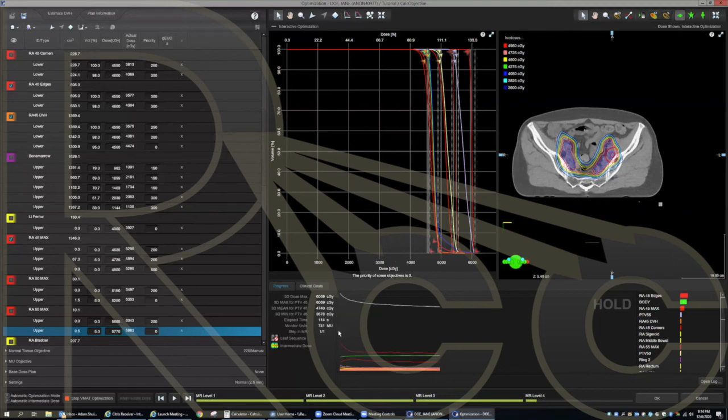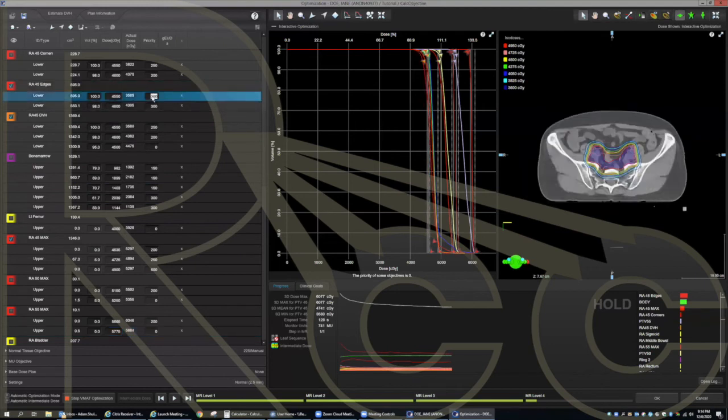I think it's tricky when you have retreats. That's when, because the doctors have expectations and you might have guidelines, you go through the wall of, okay, this is impossible for me to meet. Retreat cases, yeah, so you make decisions with the doctor though.